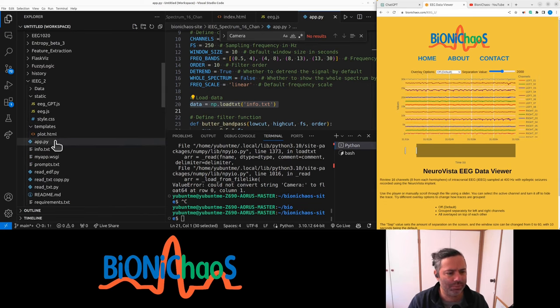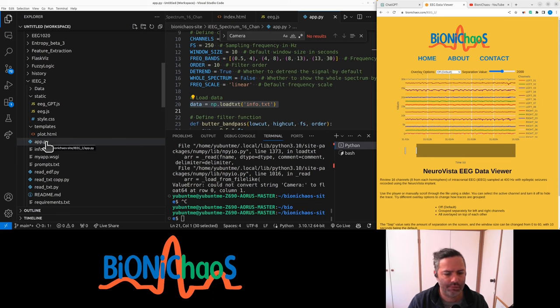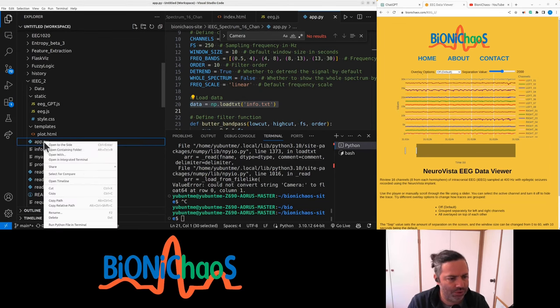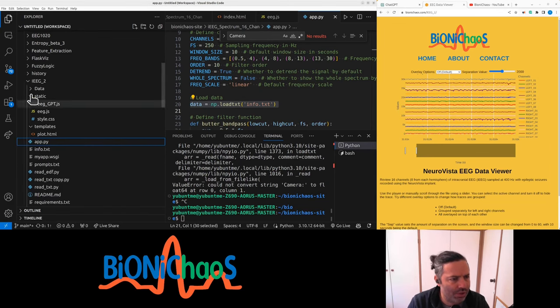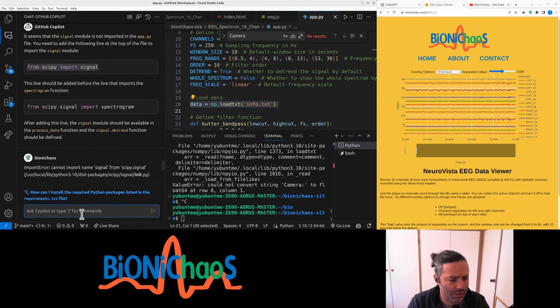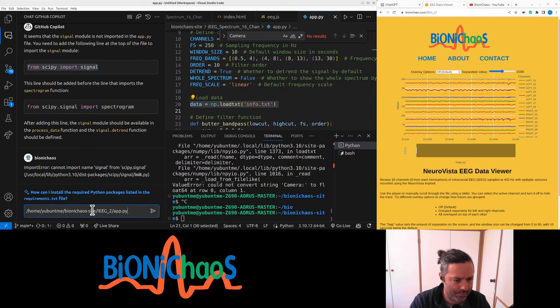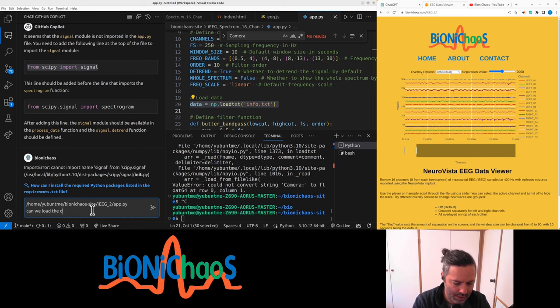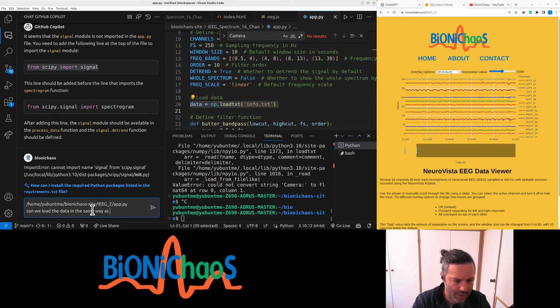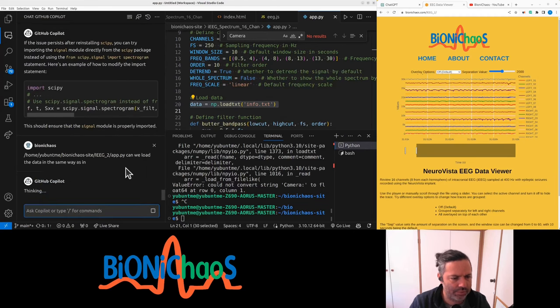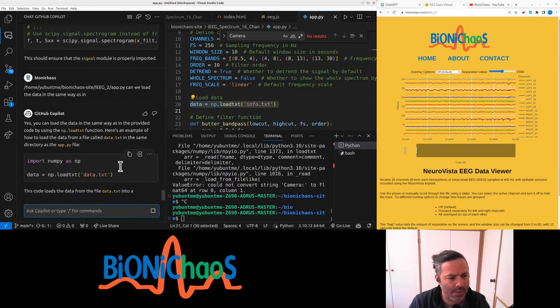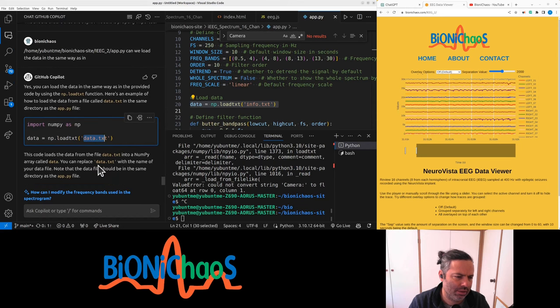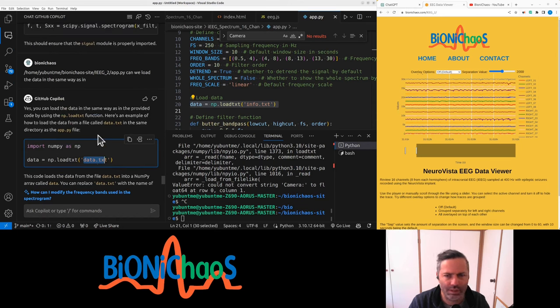So this will be - the question is if the Copilot chat has access to all other files, it should. So if I copy path and just tell it to, can we load the data in the same way as in? Yes, you can load that. Is it the text? But that's not how we load the data in that file. So I'm not sure if it has all the content from.